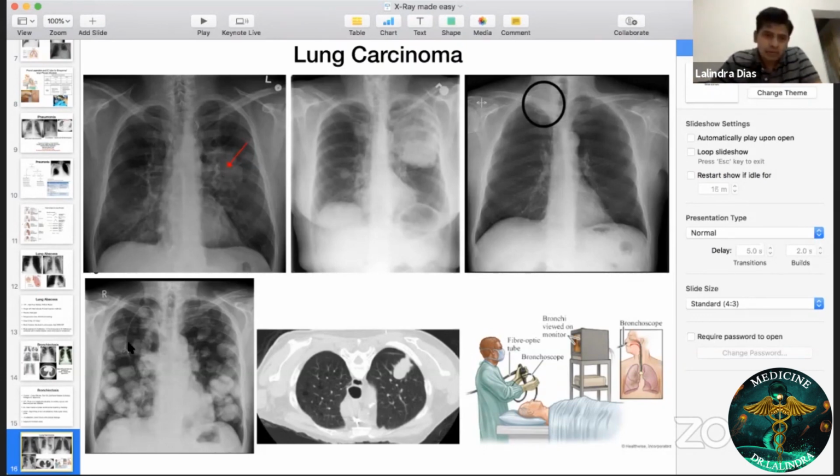And in this one, the cancer is somewhere else. Maybe a thyroid cancer, maybe a breast carcinoma, maybe a renal carcinoma. I hope you can see me clearly. In these conditions, the primary cancer is somewhere else, and the secondary metastatic deposits have occurred in the lungs. Where else can you get secondaries in the body?